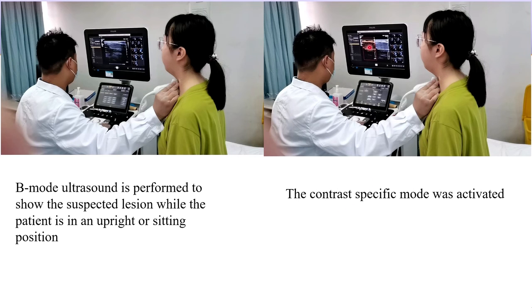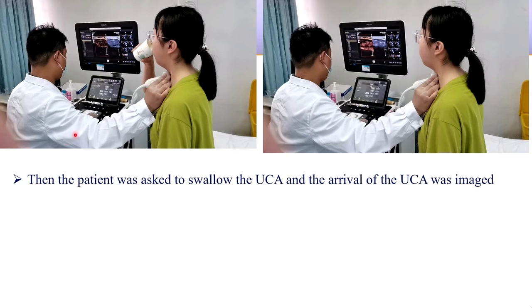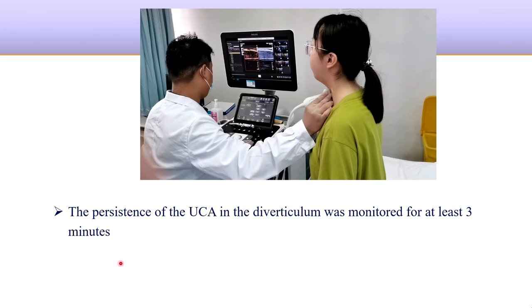Then the contrast imaging mode was activated. Then the patient was asked to swallow the contrast agent, and the arrival of the contrast agents was imaged. The persistence of ultrasound contrast agents in the diverticulum was monitored for at least 3 minutes.